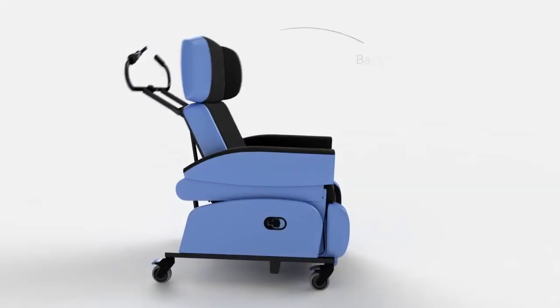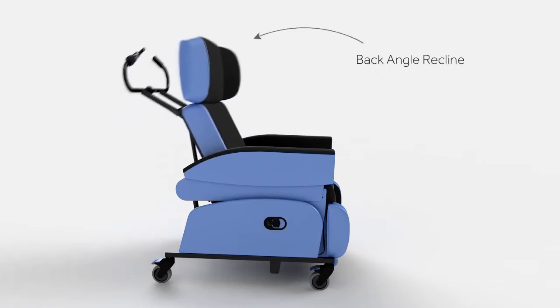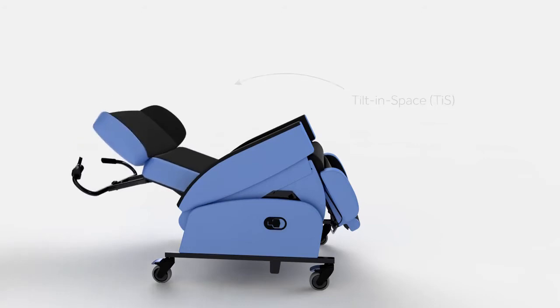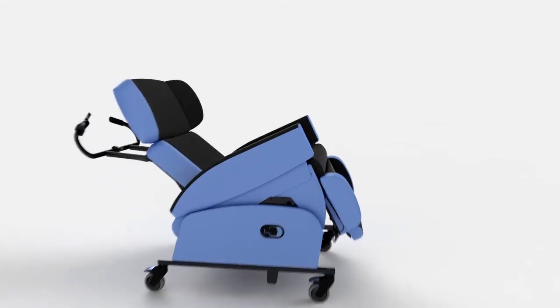The back angle recline creates a comfortable hip position, and the tilt-in-space mechanism allows the user to recline comfortably without affecting hip and knee angles.